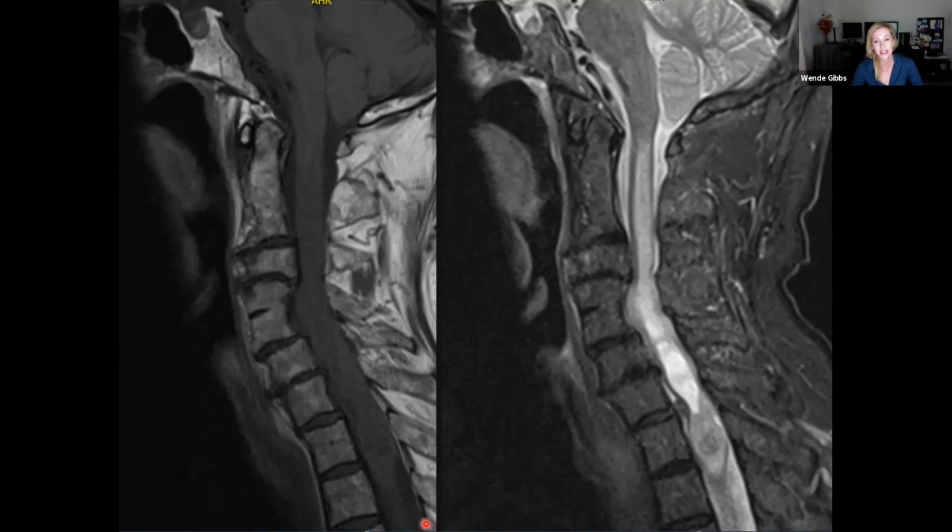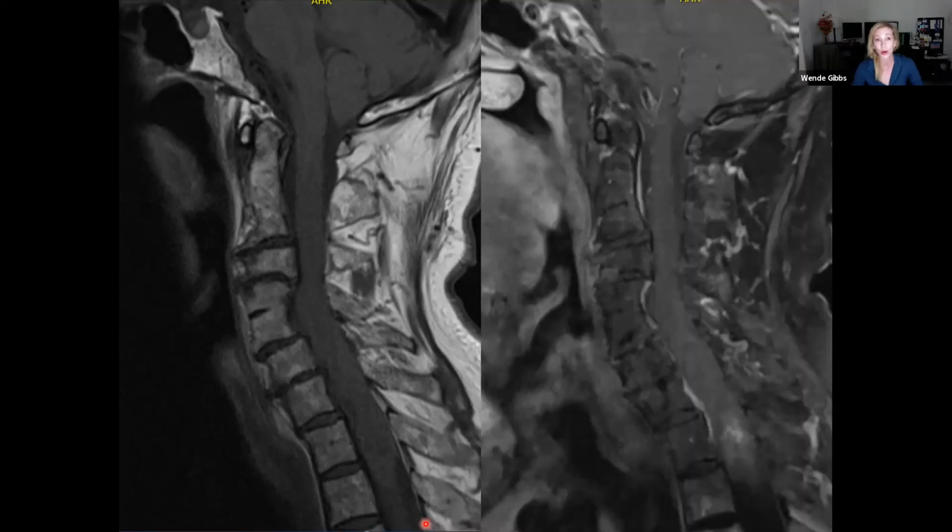And then below the bright T2, at what level? Let's see, 1, 2, 3, 4. What's that, T7 or T1? The contrast? Yeah, we could get contrast. It does look like you have something unusual below the syrinx. It looks like a mass or blood, possibly.